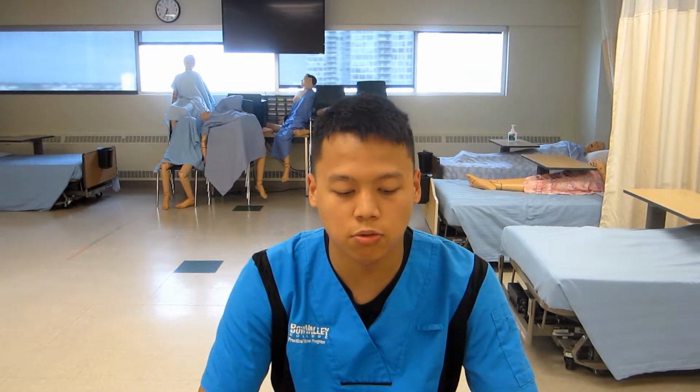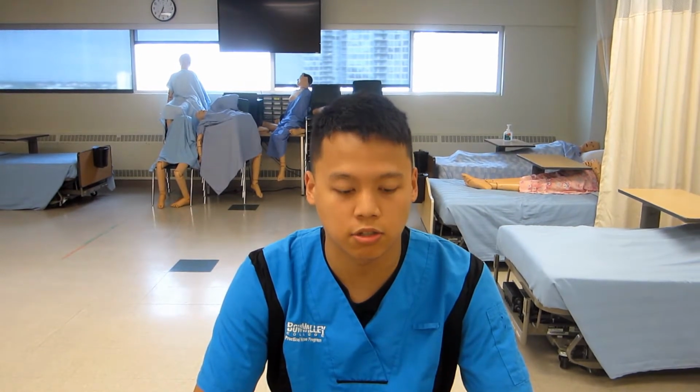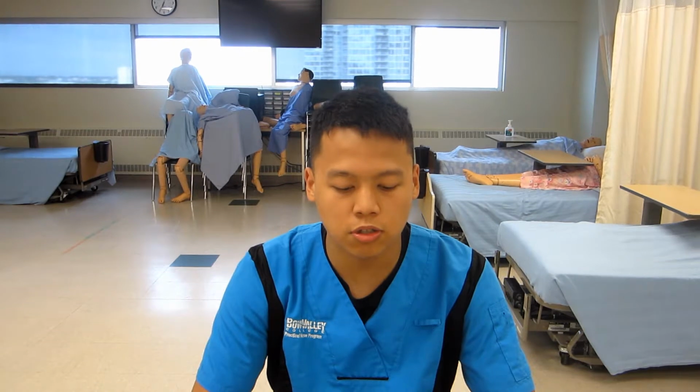Ask the patient to roll away from the stretcher. Then place the sliding board over the gap between the bed and the stretcher. Help patient return to a supine position on the sliding board and ask her to cross her arms on her chest. Each nurse should assume a broad base of support with one foot in front of the other, and knees and hips flexed, keeping the body aligned and the back straight on the count of 3.